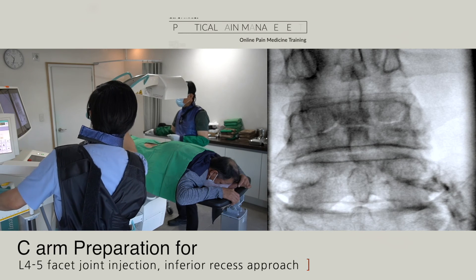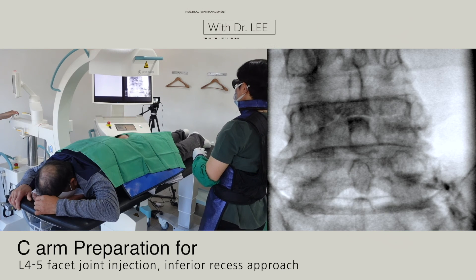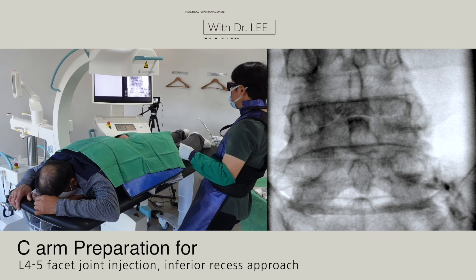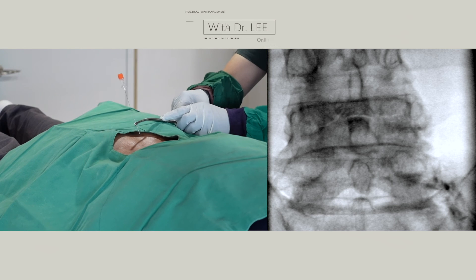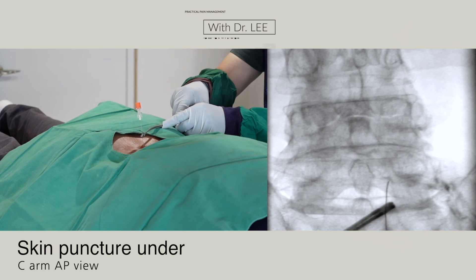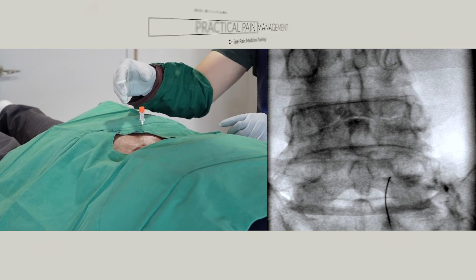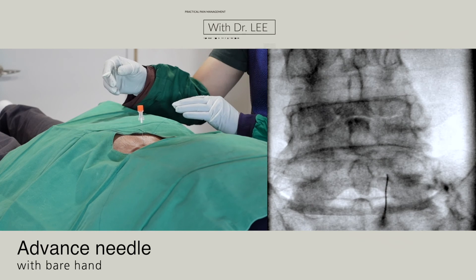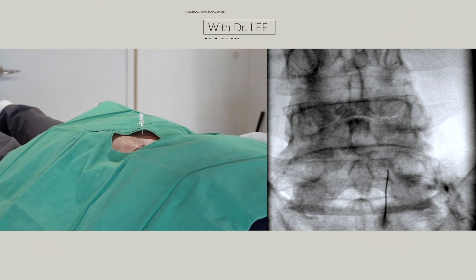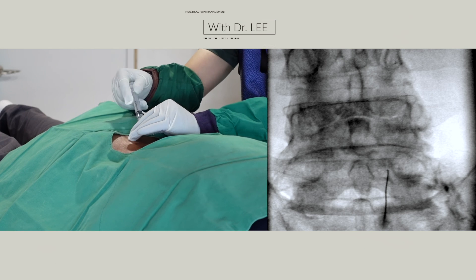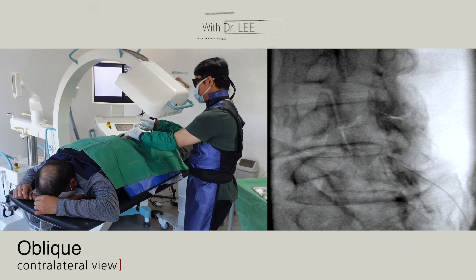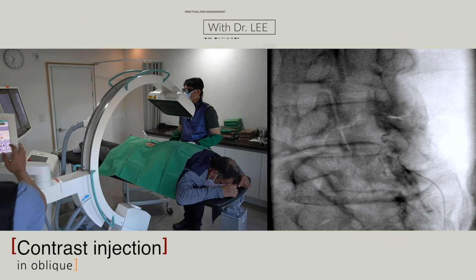I'm going to select the inferior recess for the right L4-5 facet joint injection. Skin puncture under C-arm AP view. Advance needle with bare hand. Oblique contralateral view to confirm the needle depth. Contrast injection in oblique contralateral view.